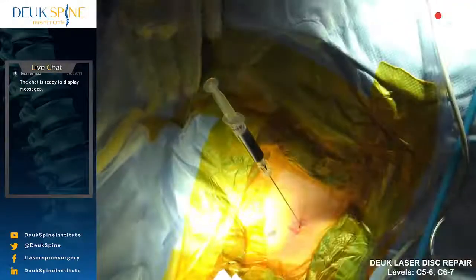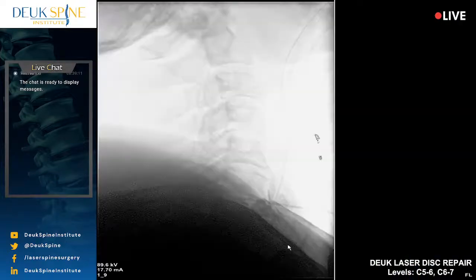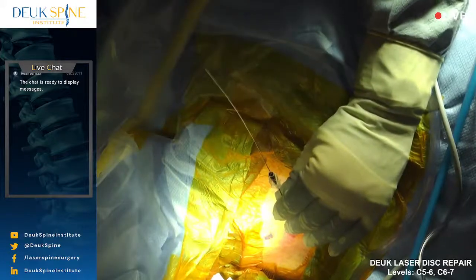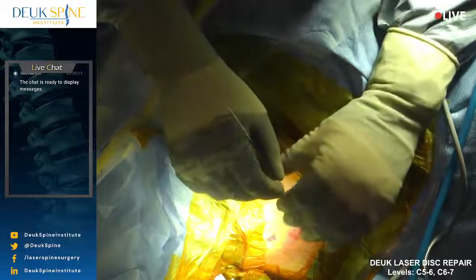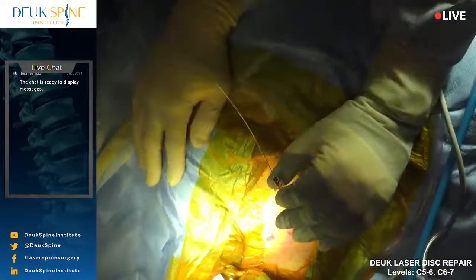All right, so you can see the needle is in the center of the disc, and we're going to be using that as our starting point. I'm going to introduce the guide wire now that I've done the discogram at C6-7. I will need to see lateral views, so you can come lower and get more penetration. Luis, go ahead.